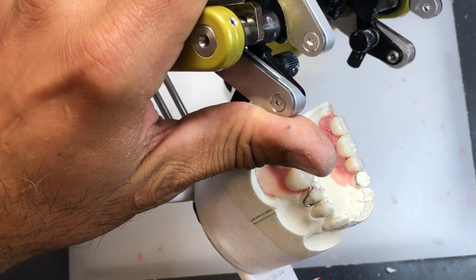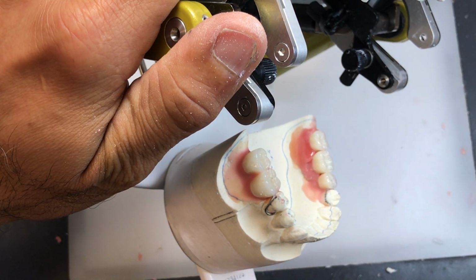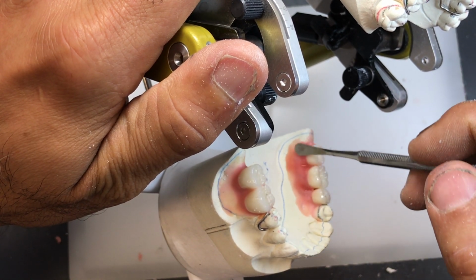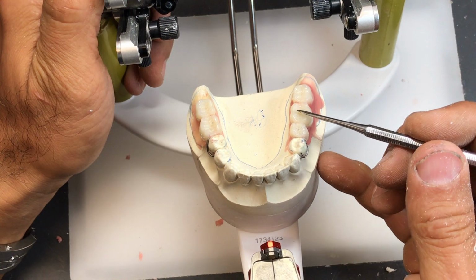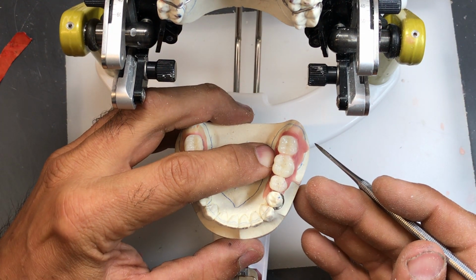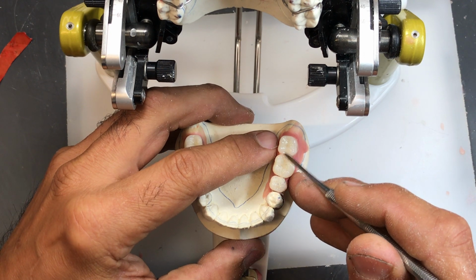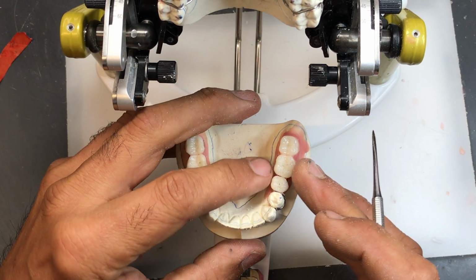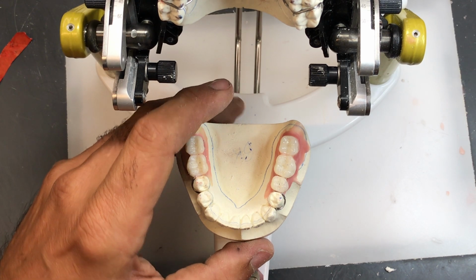And as I mentioned before, quite often you'll find that when you go on to the next tooth, you realize that the tooth before that you worked on needs to be repositioned. And this is the case here now again. And I'll show you what I mean. When I look at tooth number 36, it looks like this tooth is slightly towards the lingual. So I want to line up the central fossas a little bit more. I like this position, and hopefully my wax is warm enough to do that. Just a little more alignment of the central fossas. Now I'm going to go back to the 5, and that looks a little off. So I might have to reposition that a little bit.